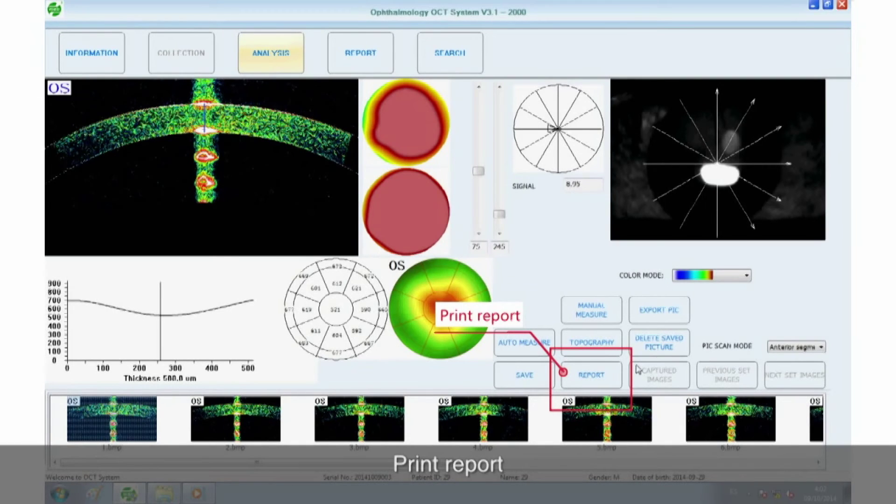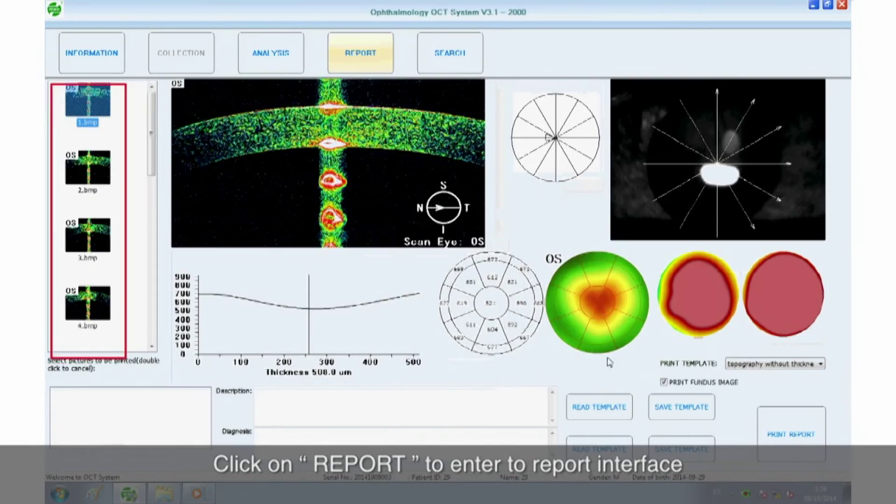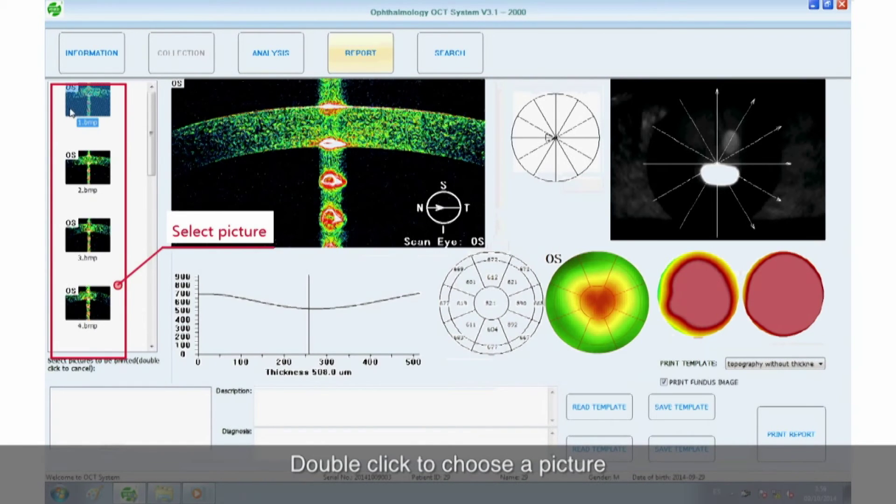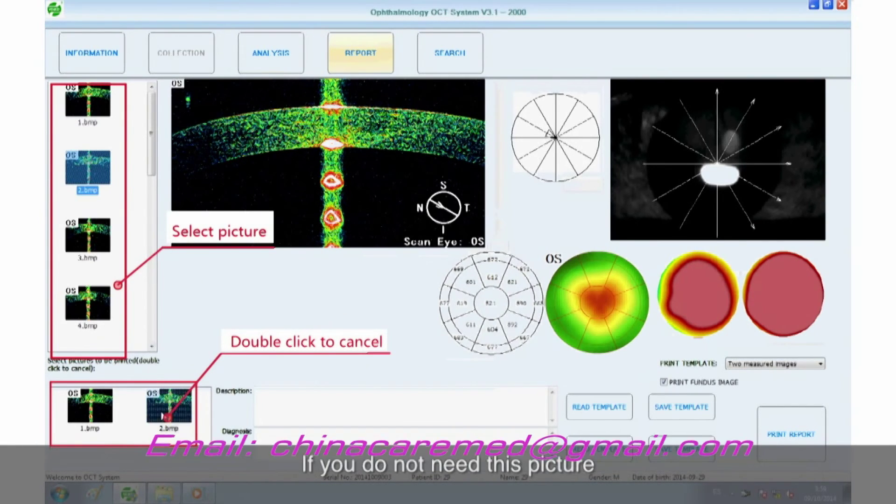Print report. Click on report to enter the report interface. Double click to choose a picture. The chosen picture will appear in the left lower box. If you do not need this picture, double click on the picture in the left lower box to cancel.